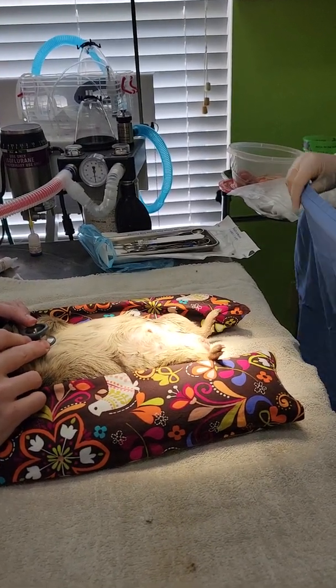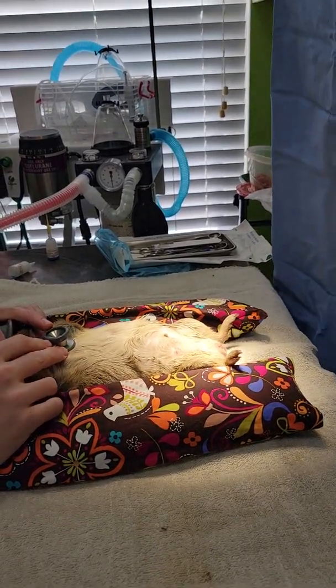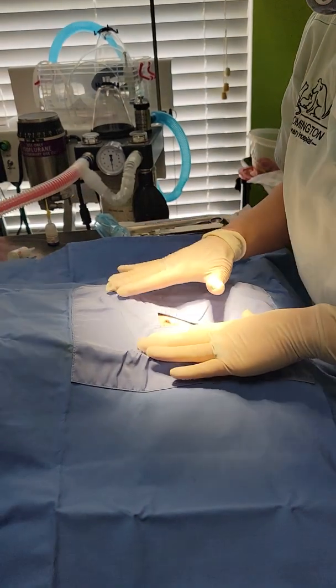Okay, so this is Castle. Castle is an approximately a thousand gram guinea pig, an adult, probably at least a year, that we are neutering today.